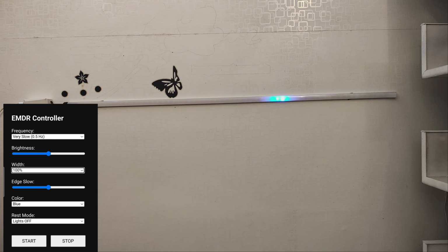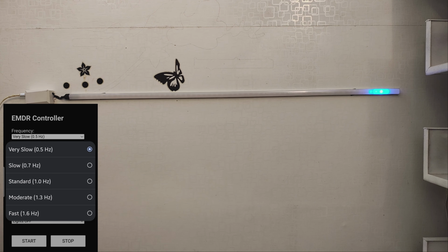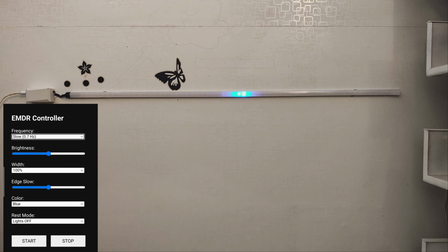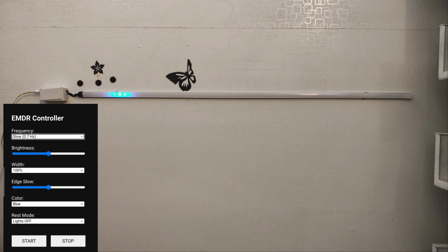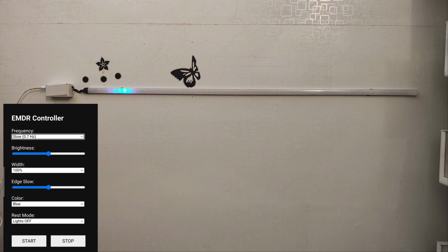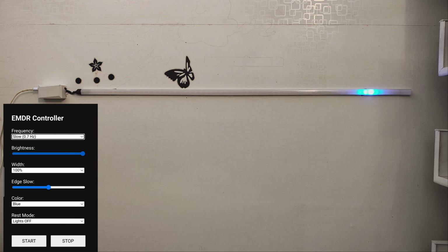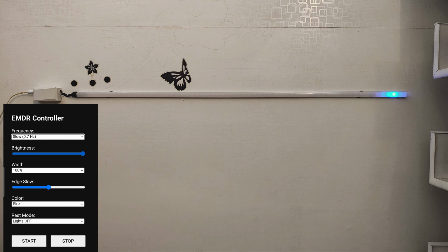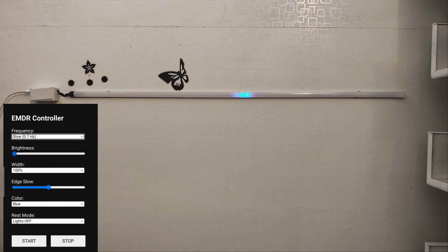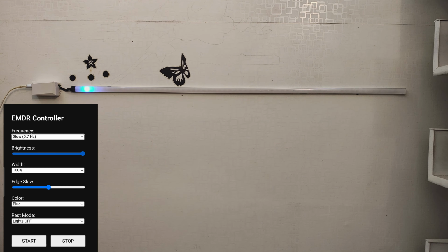Now I will show you different modes. First we will experiment with different frequencies. Different pacing profiles may feel more suitable depending on the client's level of activation, emotional overwhelm, grounding needs, and processing stage. Now this is the 0.7 Hz. It is best for deep trauma processing, reflective emotional exploration, and sustained focus on difficult memories. I can adjust the brightness.